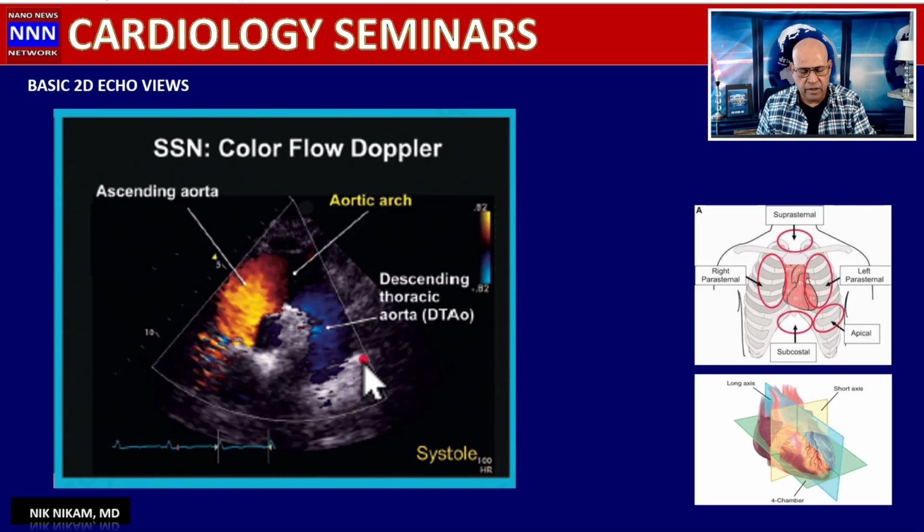Echocardiography is exceedingly useful in diagnosing the structure of the heart, the size of the heart, the ventricular function, wall motion abnormalities, hemodynamics, pressures, compliance, and a lot more. We can even measure cardiac shunts and evidence of fluid, tamponade, you name it. Echocardiography is a very, very essential study in the field of cardiology when we are evaluating patients with coronary artery disease or structural heart disease.